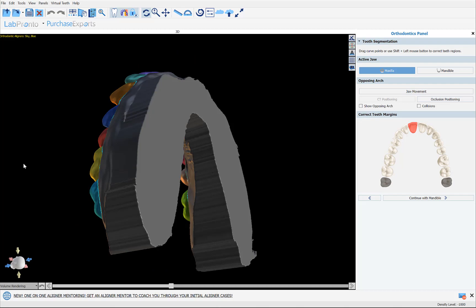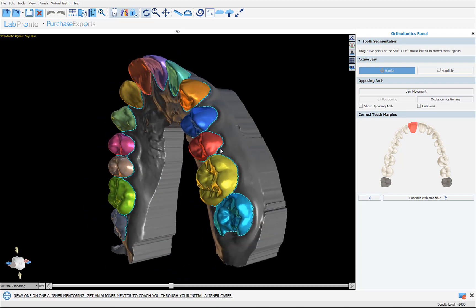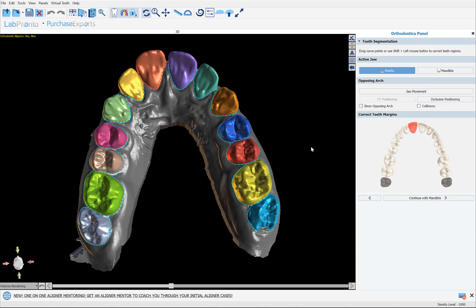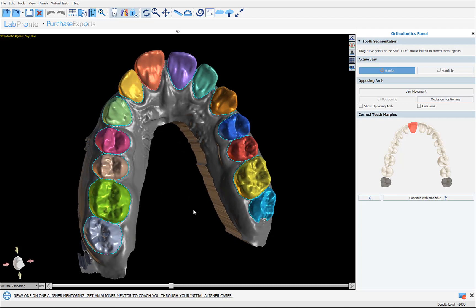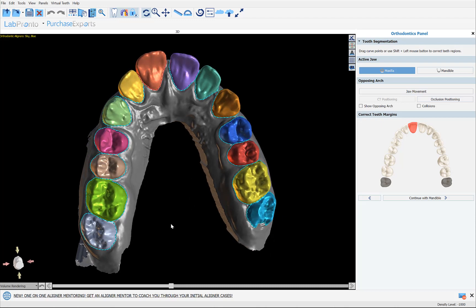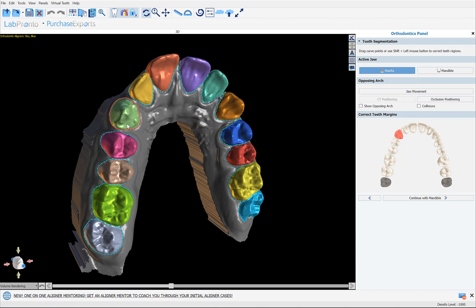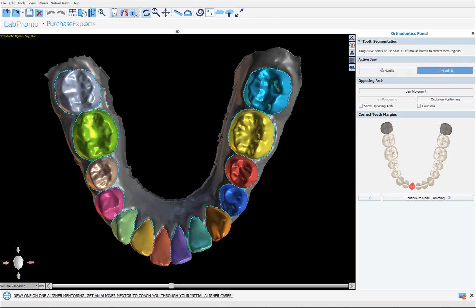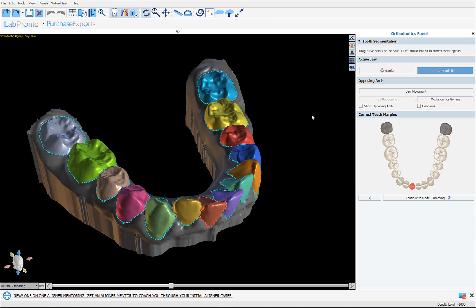Then click Continue to Teeth Segmentation. We get to the next step with the models closed, and we have settings where you could decide on the height of the base, the distance from the gingival margin, and other things — that's in the Properties. The teeth have been automatically segmented and we can see the improved segmentation connected based on the improved deep learning annotation. If you need to fine-tune any segmentation curves, simply left click the relevant tooth and grab, drag, or redraw as needed. I'm going to click Continue with Mandible, and here we see our completely automatic segmented teeth.